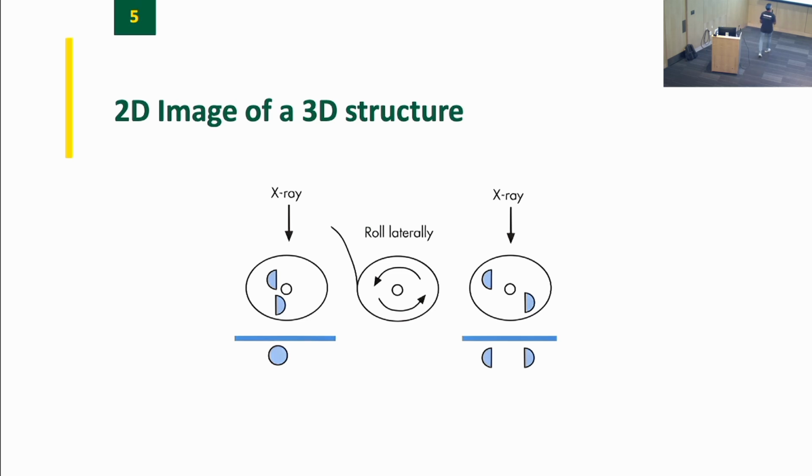In breast imaging, let's assume that the circle is cancer and the semicircle is not cancer. In this projection, the X-ray source is up top. You're passing it through two benign semicircles. Because of the way they're aligned, when you project them into a 2D plane, you get a circle. It looks like you have cancer on the image, right?